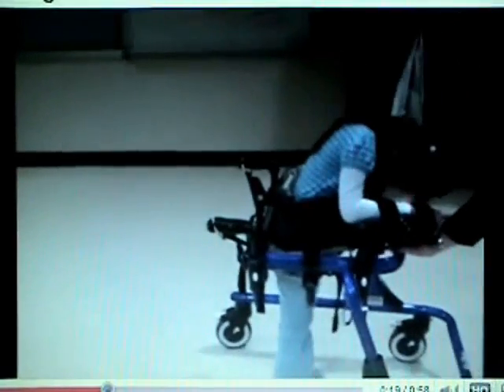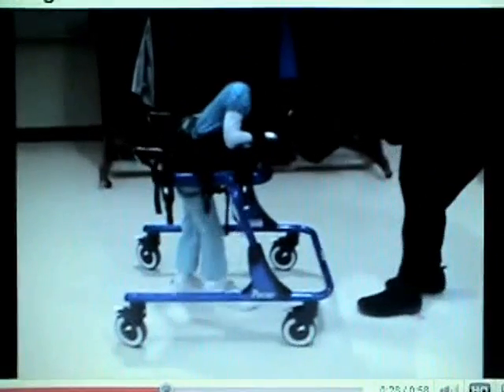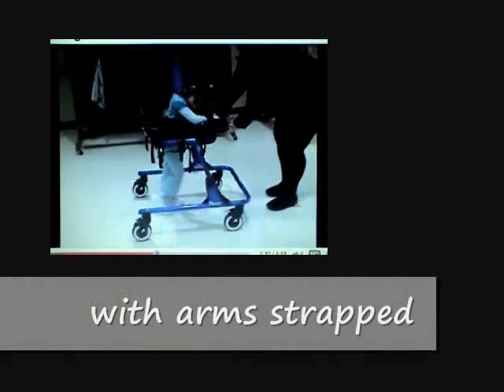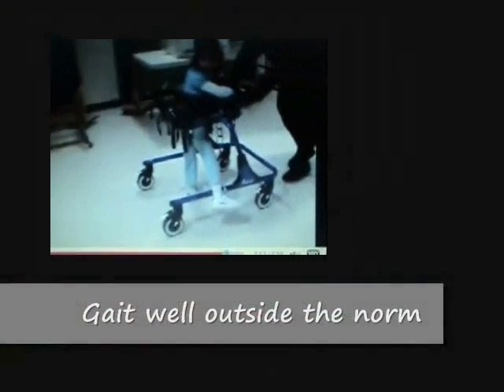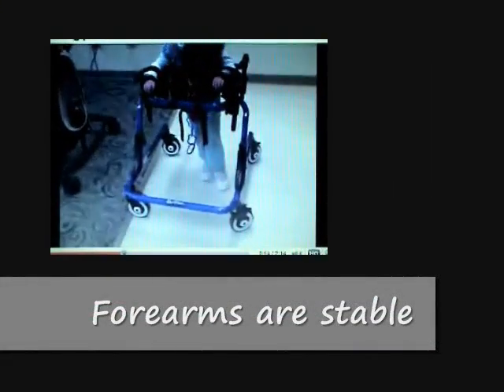This is our first patient. You can see we're looking at stabilizing the upper trunk in this particular gait trainer or walker. We use this a lot — we see a lot of therapists use this kind of device. The arms are firmly strapped in and the upper trunk is very stable, but we're not doing anything with the lower extremities. As we can see, she's going in pretty much any direction with her lower extremities. She's very enthusiastic, but have we improved the gait? We're well outside normal gait as well as outside the gait trainer — this is not an optimal way of bringing our kids to a higher level of function.